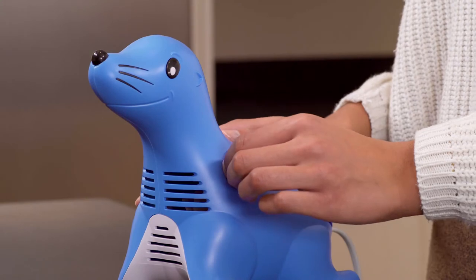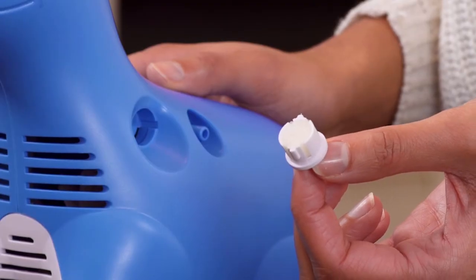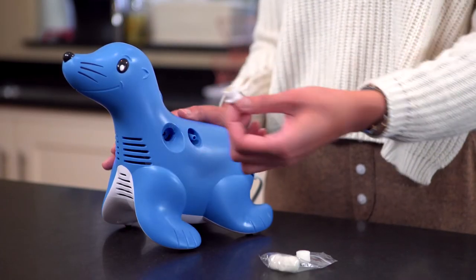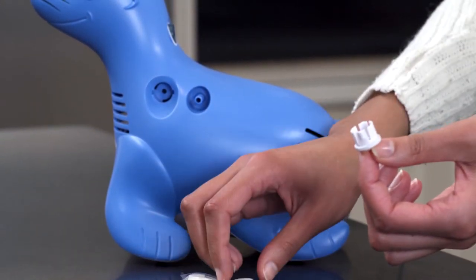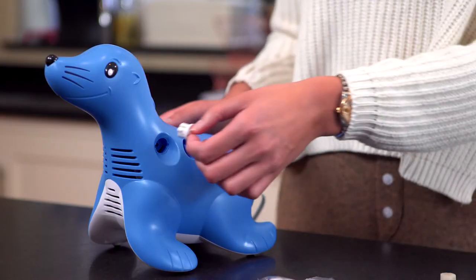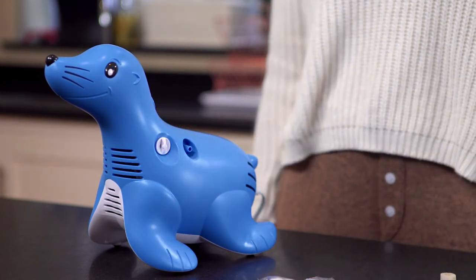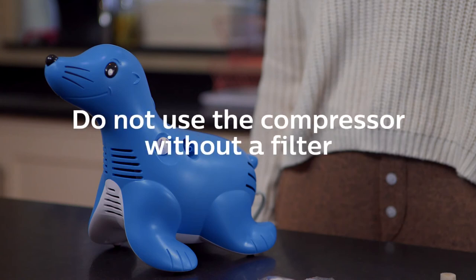The filter should be checked regularly. The filter should be replaced when it becomes discoloured or dirty, clogged, or wet. To change the filter, twist the white filter cap and remove it by pulling out. When replacing the filter, make sure it is fully inserted and twist it to lock it in place. Do not wash or reuse the filter. Do not use the compressor without the filter.